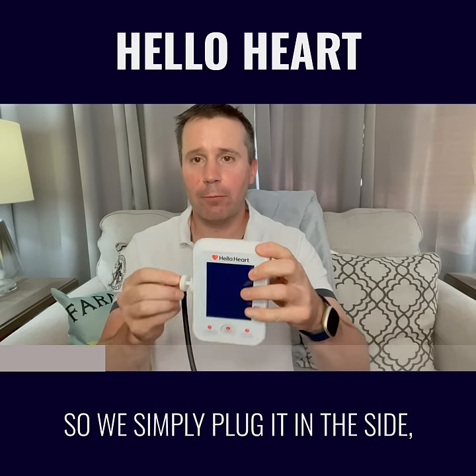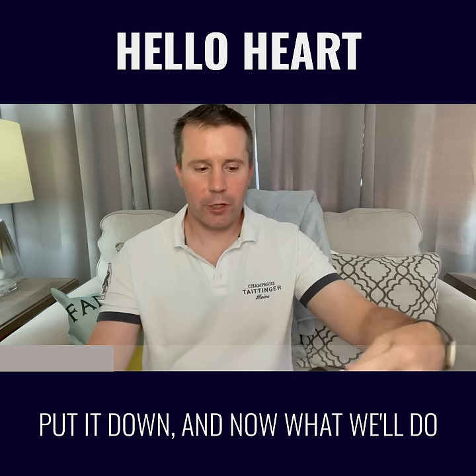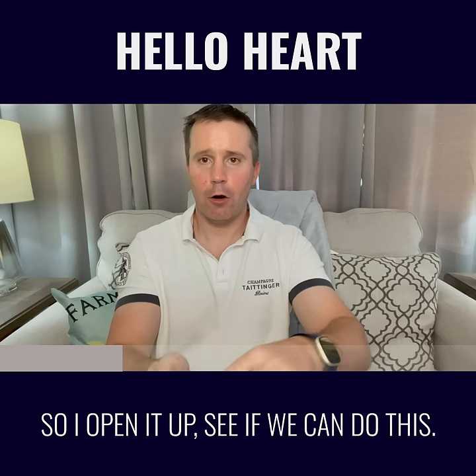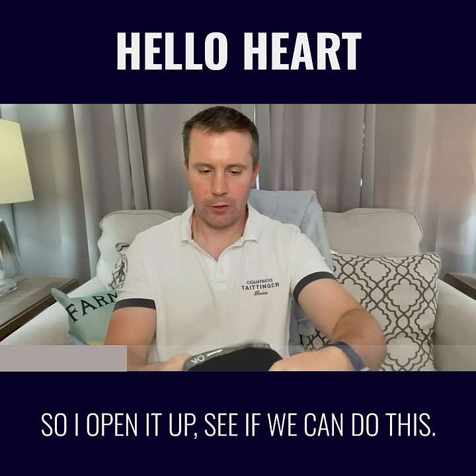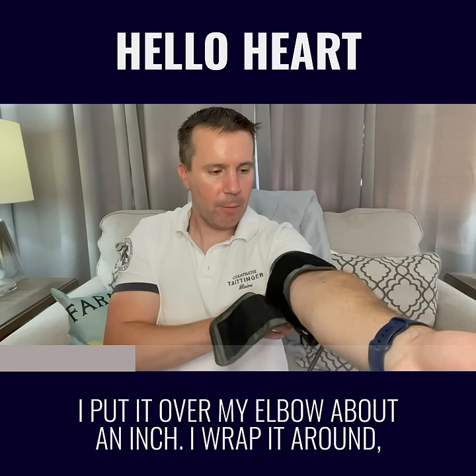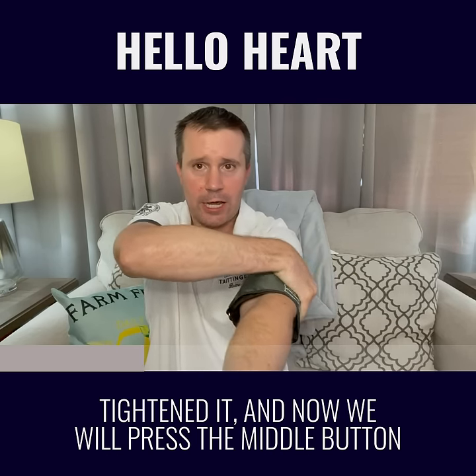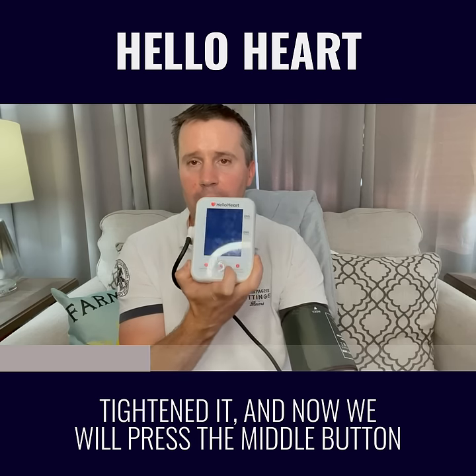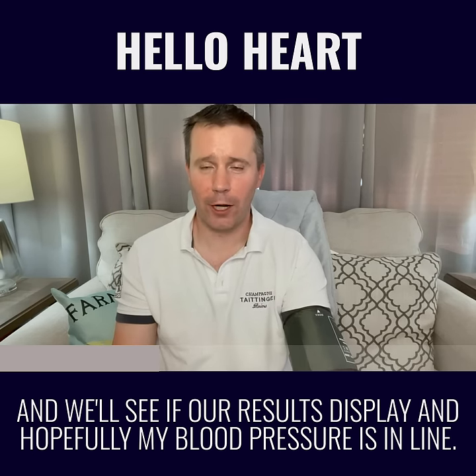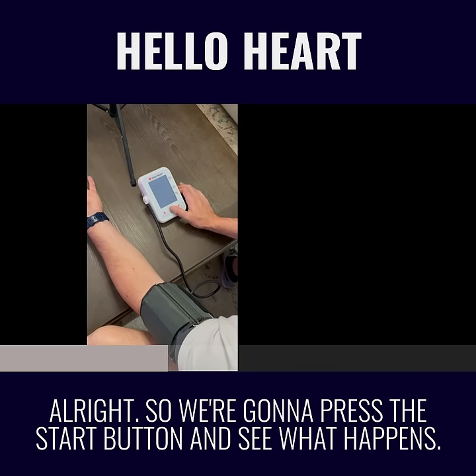So we simply plug it in the side, put it down, and now we'll take the cuff and turn it around our elbow side. Open it up. I put it over my elbow about an inch, wrap it around, tighten it, and now we'll press the start button and see what happens.